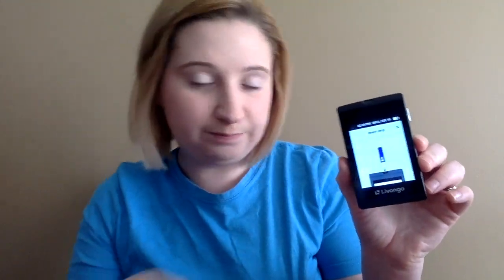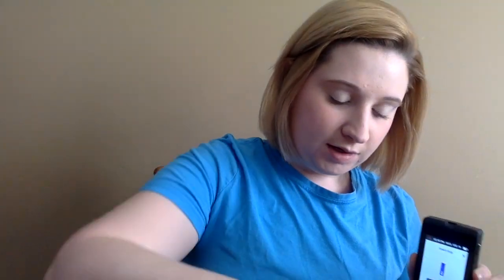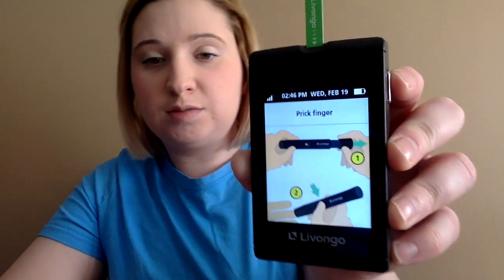Insert strip. So the strip that I had, obviously you want to make sure you're putting it in the right way. So where it says Livongo, you want to make sure the blood's going to go right here. Very fancy. Okay, so you insert it at the top. I was expecting the bottom, but you insert it at the top. Checking strip, it says. And then it says prick finger. Man, I love this. This is wonderful.